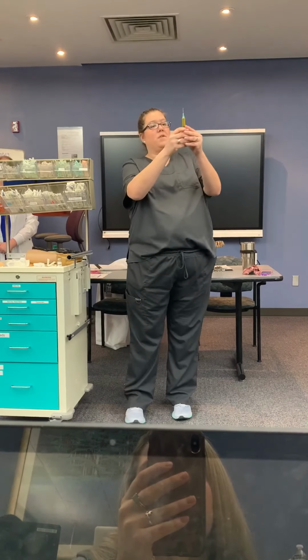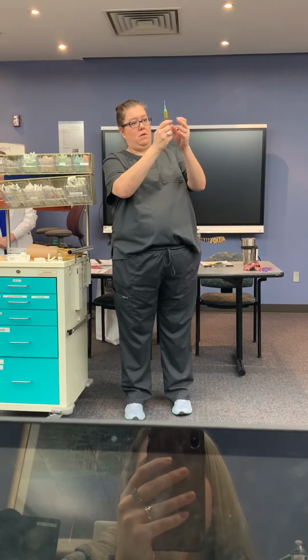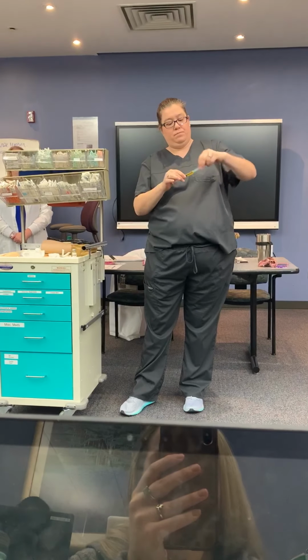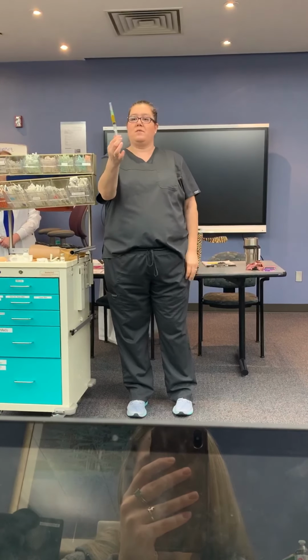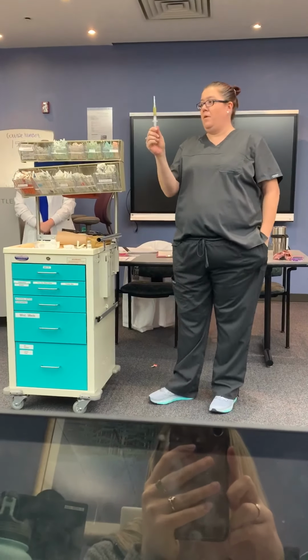And we should have our perfect 4 milliliters. There it is. Ready for administration. Okay, and how many does she get?